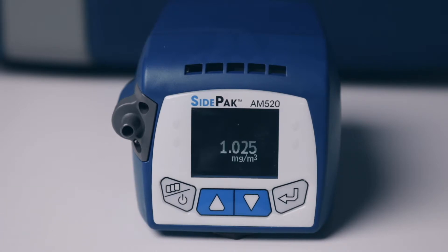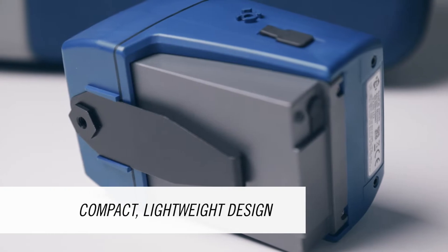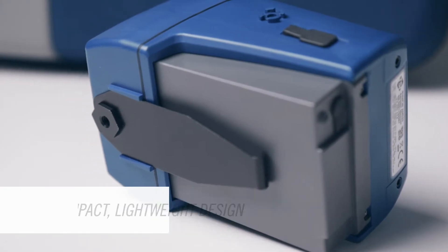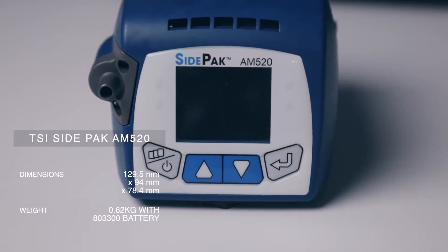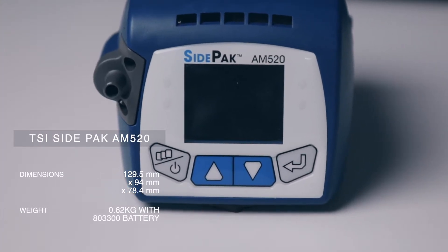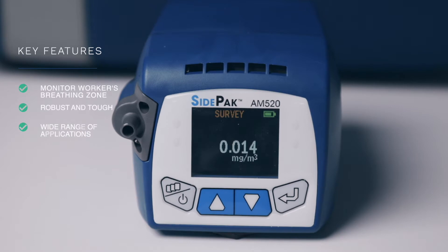The lightweight nature of the monitor means it's comfortable and easy to carry on a job, with minimal interference with worker activity. TSI have designed this to be the smallest and lightest battery-powered personal photometer on the market. It's portable and able to monitor a worker's breathing zone.